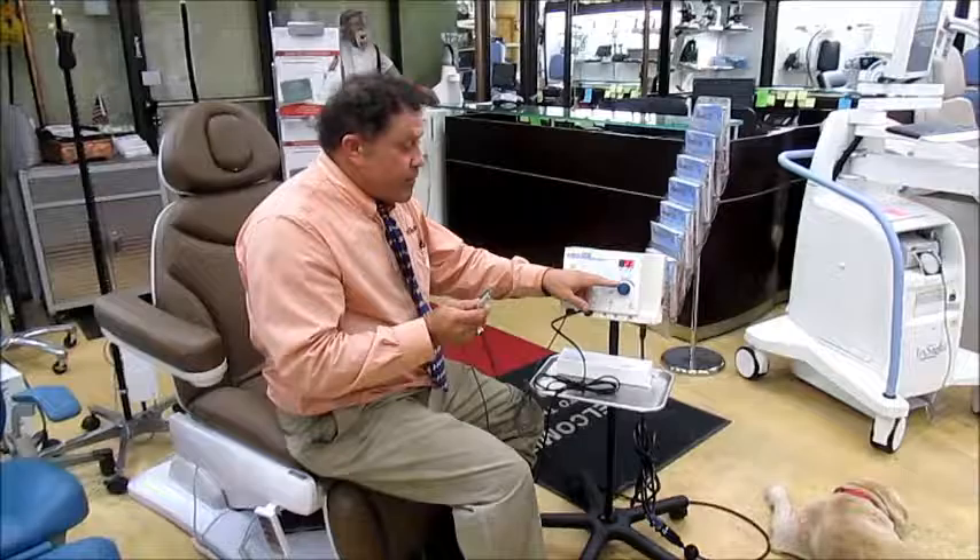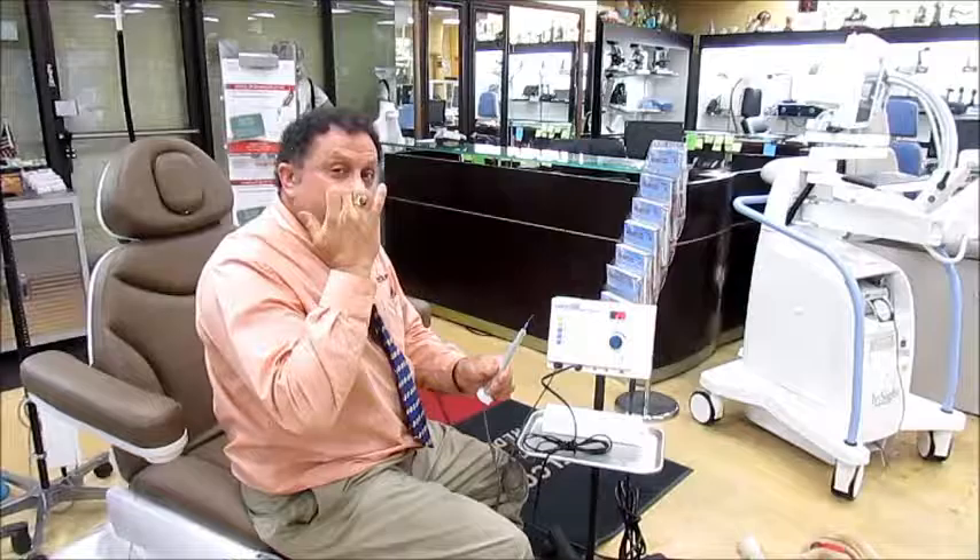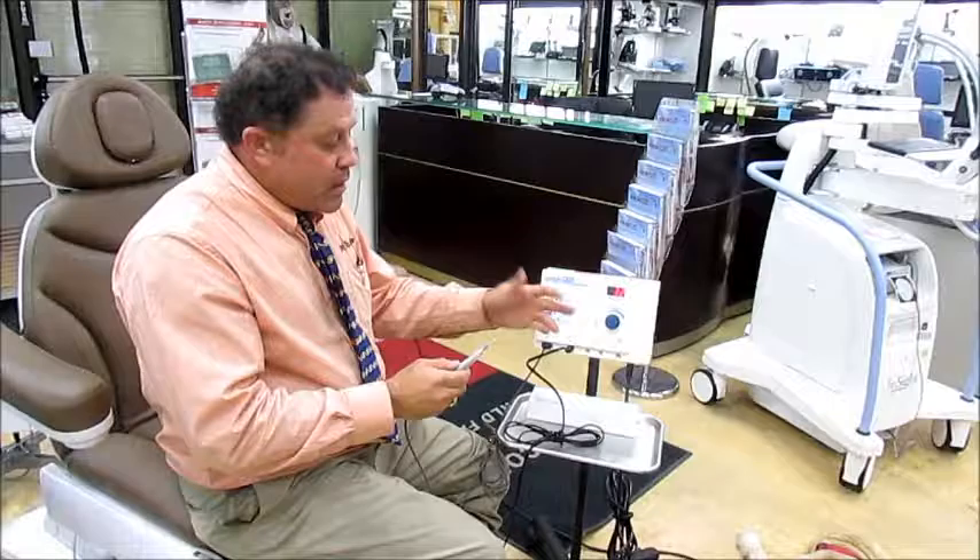Ellman makes one too that we sell. If you turn it up it has more power, and that's all it does — burns moles, warts, skin tags. You can also get the little loop on the end to shave down the nose or do LEEPs. This will work for LEEPs — of course you need a speculum that's non-conductive for electricity — and you can turn it way up to 32.